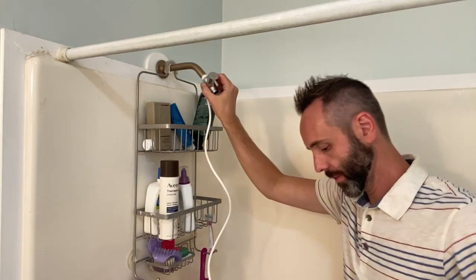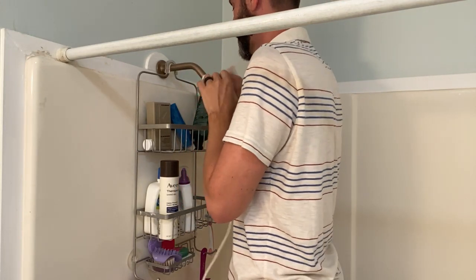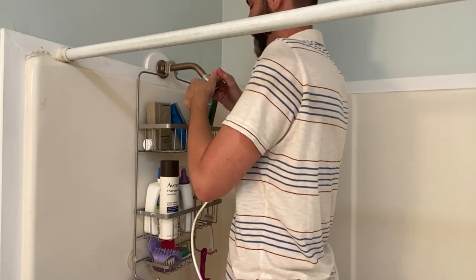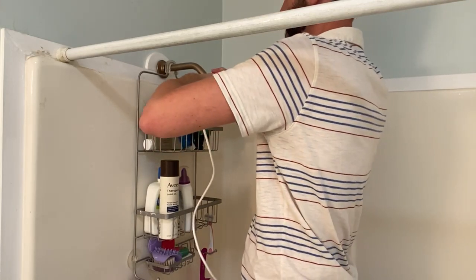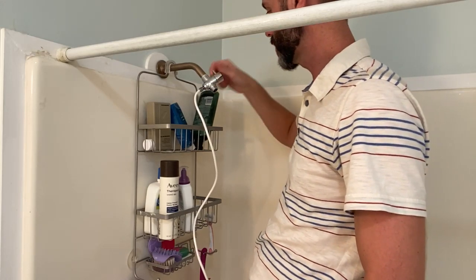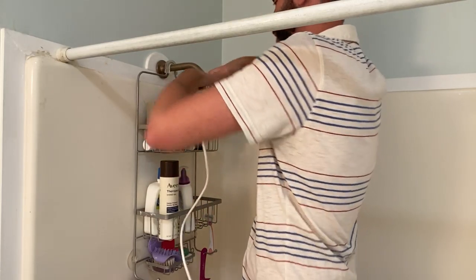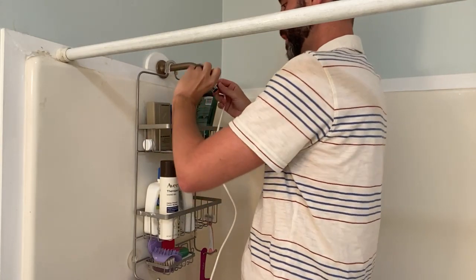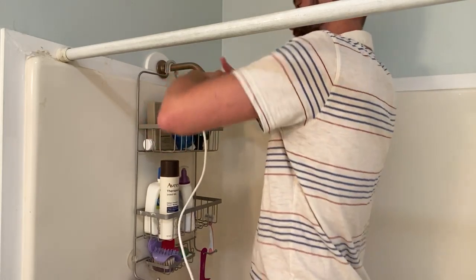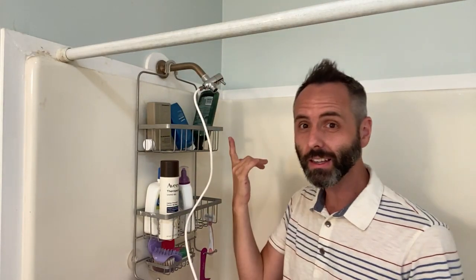Just gotta line it up — okay, it's going on. Boom shakalaka! I want to turn it pretty tight to make sure we have a good hold. This right here is your valve that turns it on and off — it's got a nice fluid turn. Since this is for our kids too, I might want to consider having it positioned a little lower so they have enough reach.